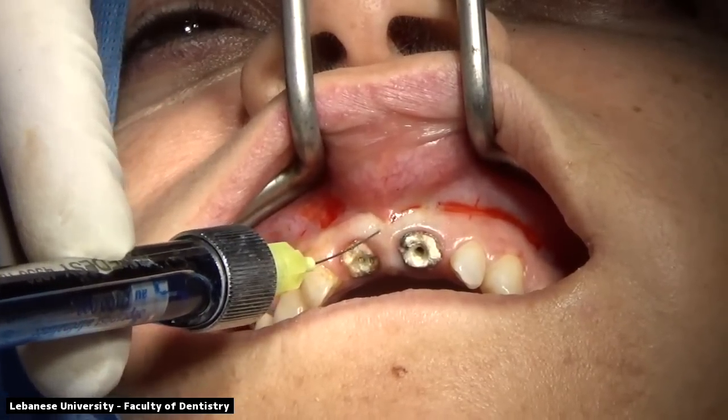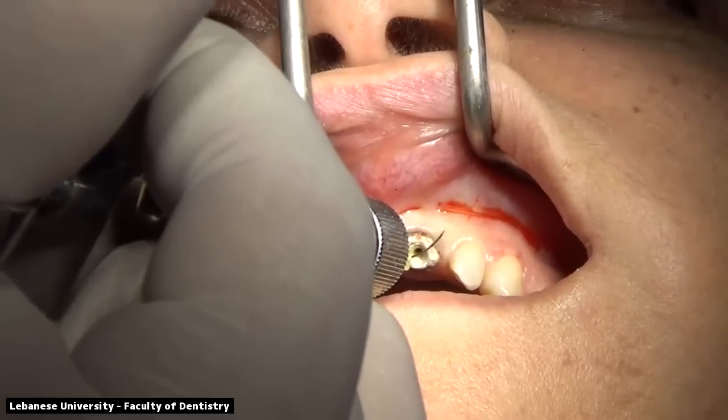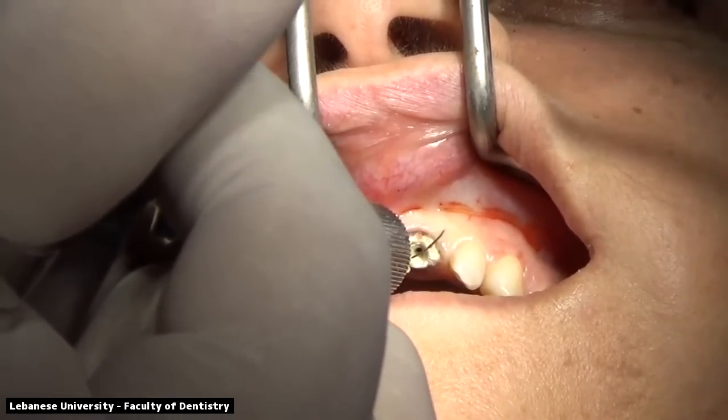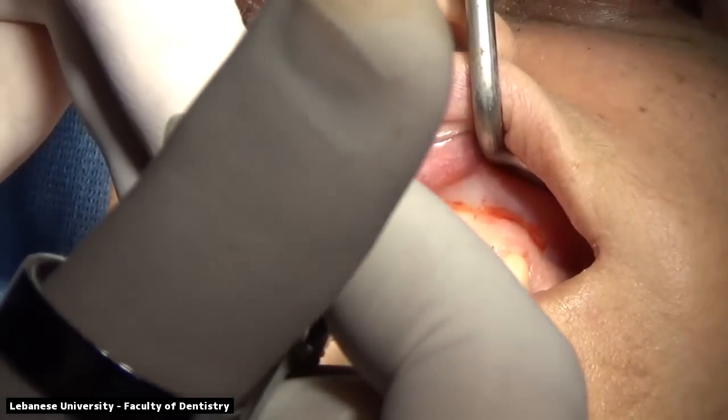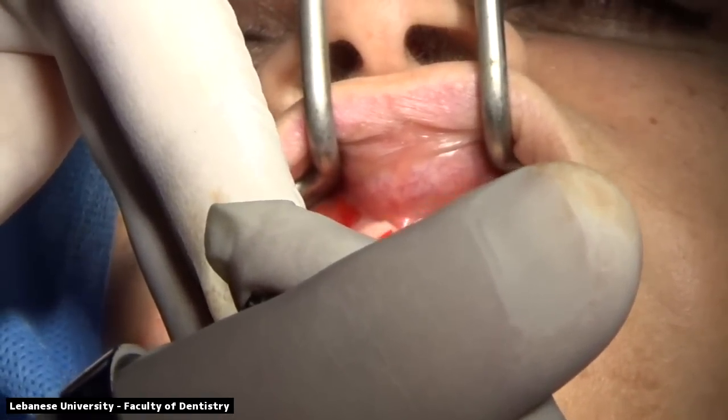The good thing with this case is that we have a thick band of keratinized tissue, so we can do the gingivectomies without worrying about losing the keratinized tissue. We will have more effective removal and a good profile after the crown lengthening procedure.